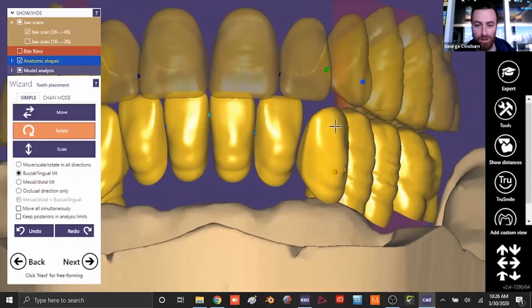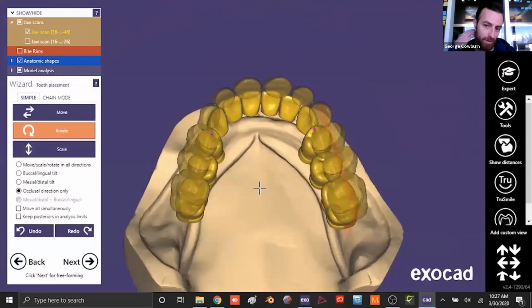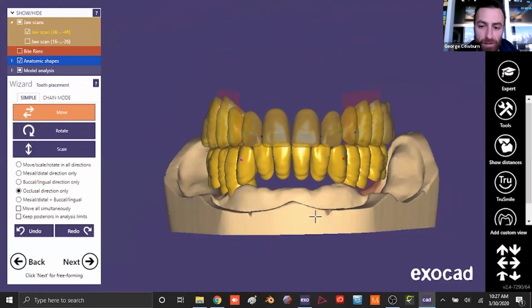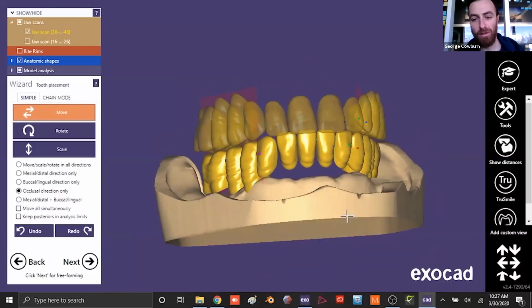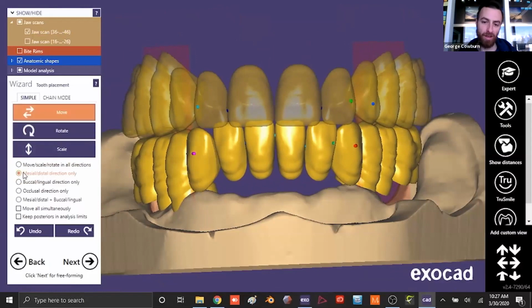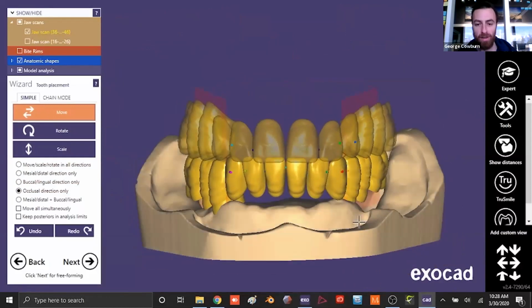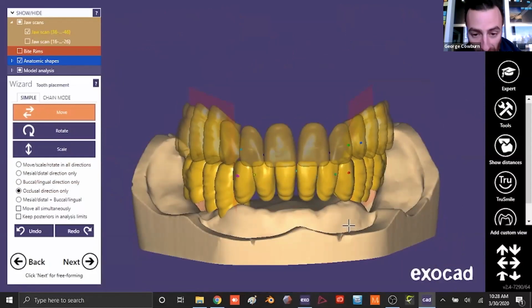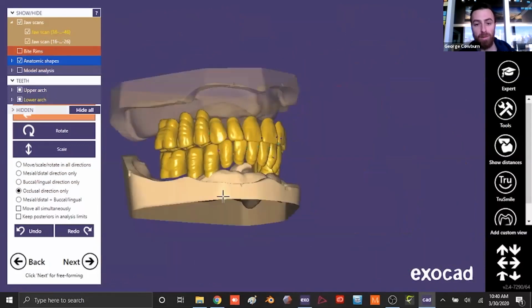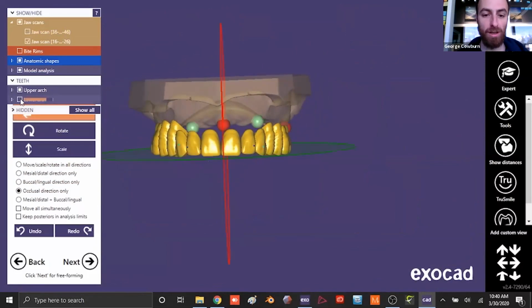Now, it should also be mentioned that dentures are one of the highest remakes of most things in dental lab, and it's because of the information. A lot of times, the reason we're doing try-ins is to verify the bite. Quite often, the bite information won't be perfect coming from the clinician. So this is why we really like to do try-ins and to make sure that things are ideal before we go into the manufacturing. This is what 3D printing has been a game changer for, in my opinion, as we're able to print different iterations and really make sure that the patient is very satisfied with the end result, as it's not very costly for us to make different arrangements.